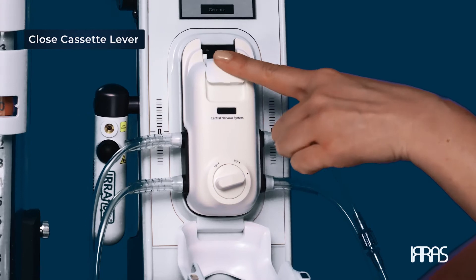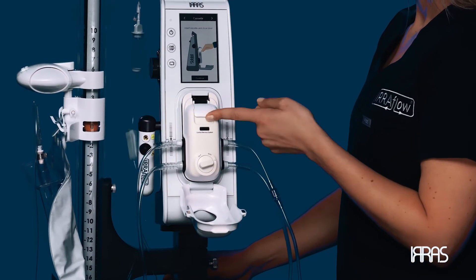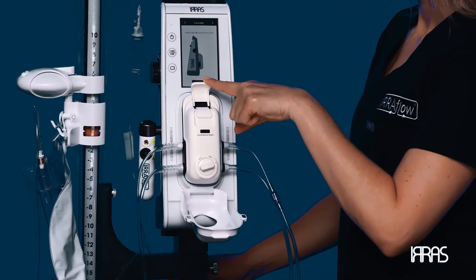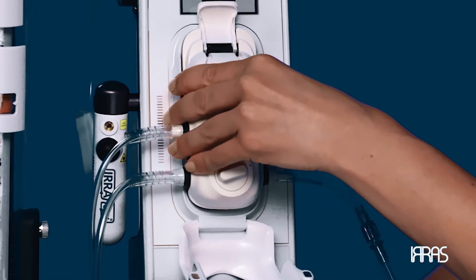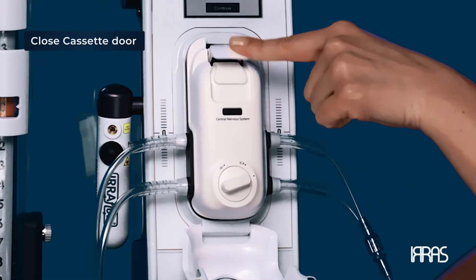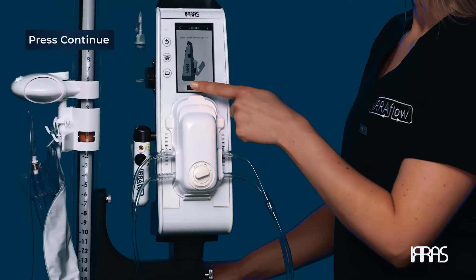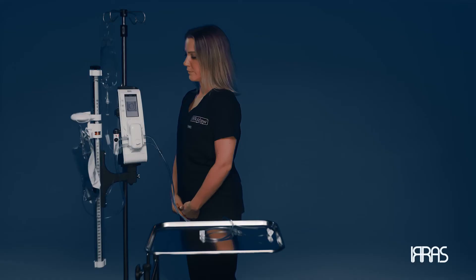Once you have attached the cassette, close the cassette lever — this will lock the cassette into place. The cassette lever should easily go down. If excessive resistance is felt, open the cassette lever, reinsert the cassette, and try again. Close the cassette door as illustrated on the control unit touch screen. With this sequence complete, press the continue button on the screen.